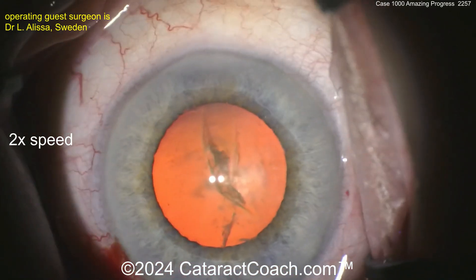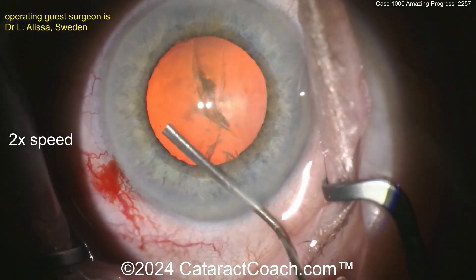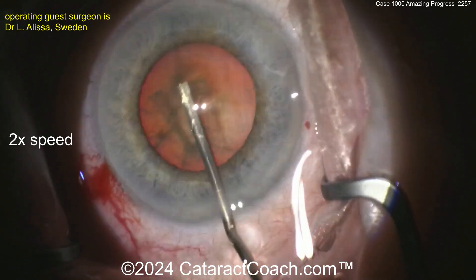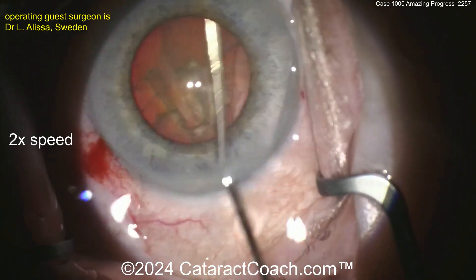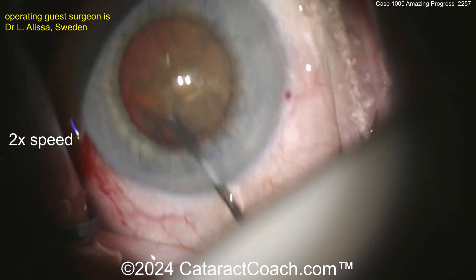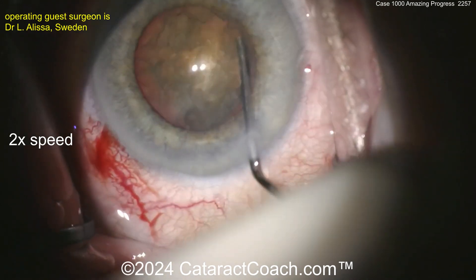Now let's see the hydrodissection. What do you think is going to be the technique of nucleofractis? I haven't watched the video yet, watching for the first time with you. Hydrodissection there, more hydrodissection — get this thing rotating. If it does not spin, you will not win. But it's spinning, so you're going to win. It looks very good.